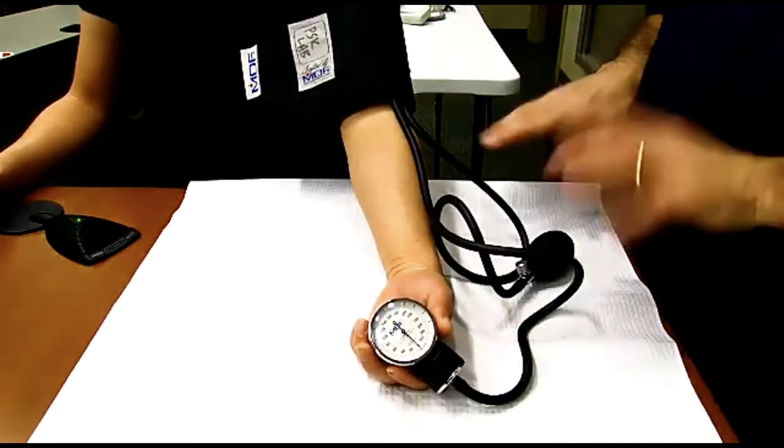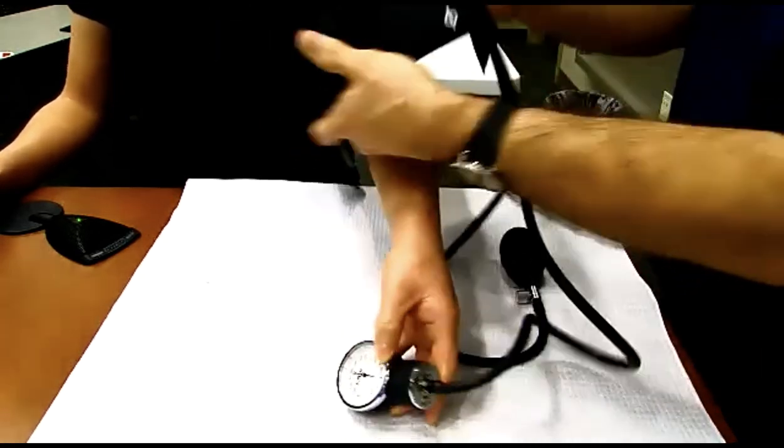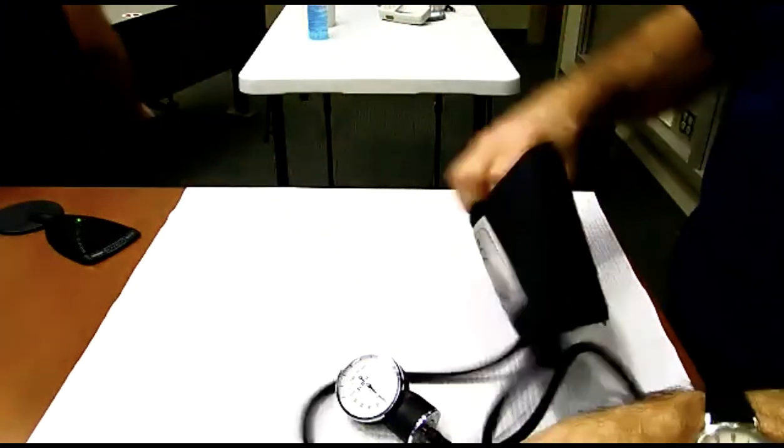Okay. The other thing I will tell you, and well, okay, so then you would remove the cuff from the patient and give them their values and say thank you very much. And thank you very much, Judy.